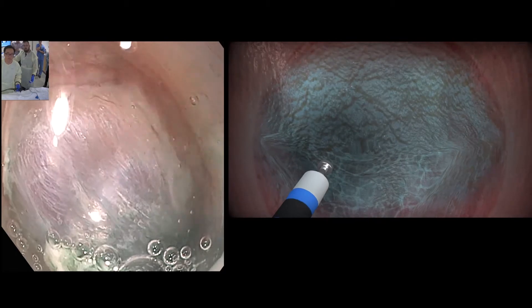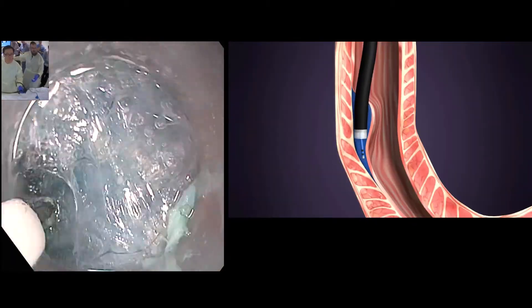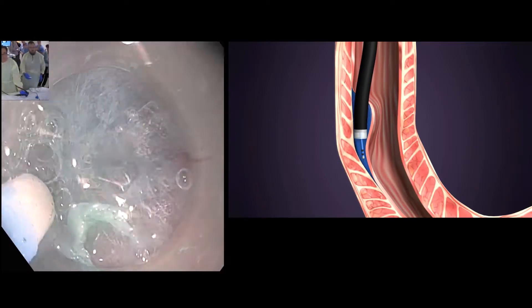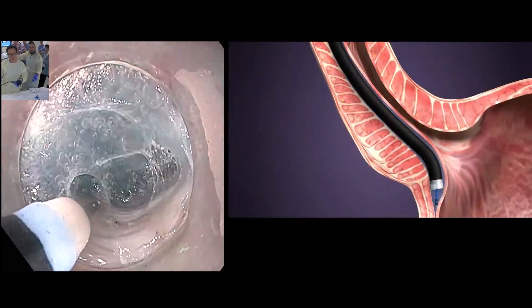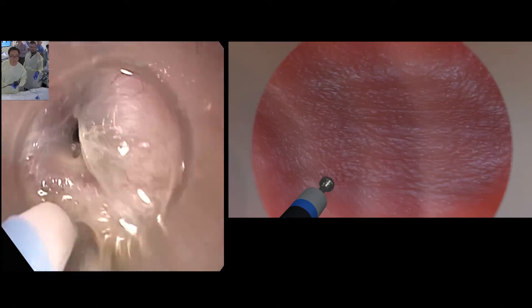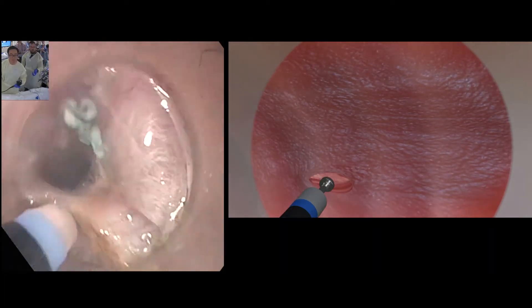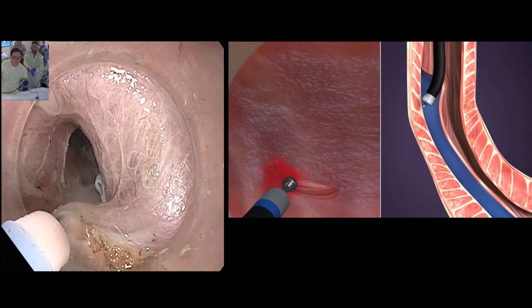Here I'm extending it all the way down to the stomach and creating this new space. Sometimes there are some blood vessels that I could see, and I can easily coagulate them with this special knife seen here. Once the tunnel is completed, then I reposition to cut the muscle. Here we're cutting muscle — you can see the thick fibrous muscle that I'm now cutting, now that I've safely created this tunnel.